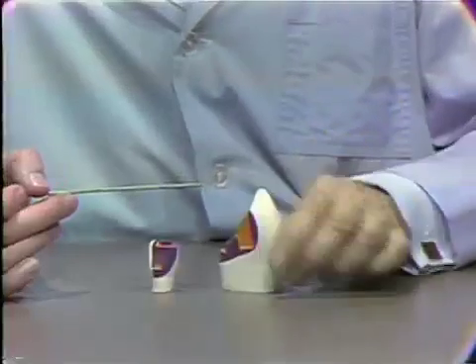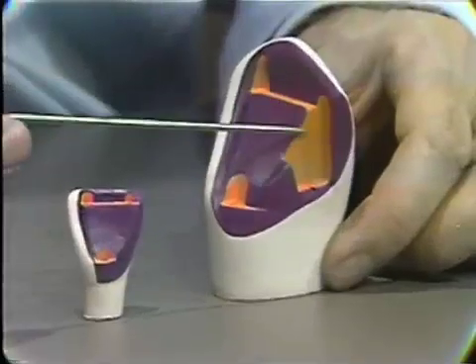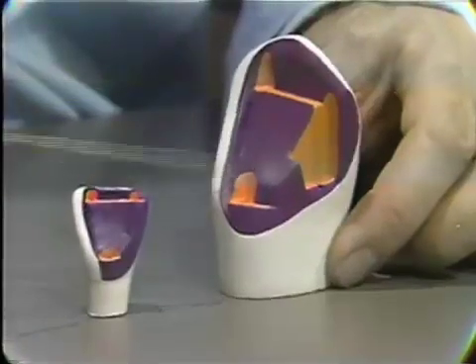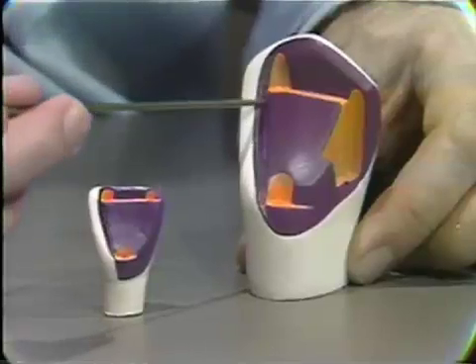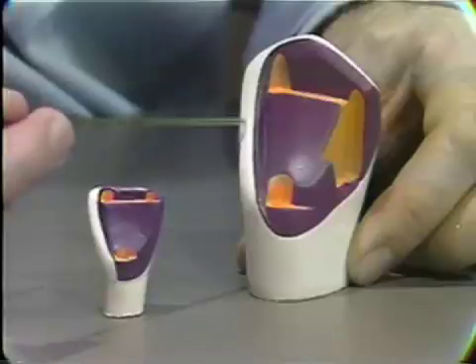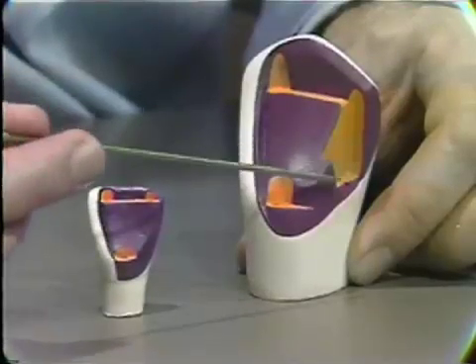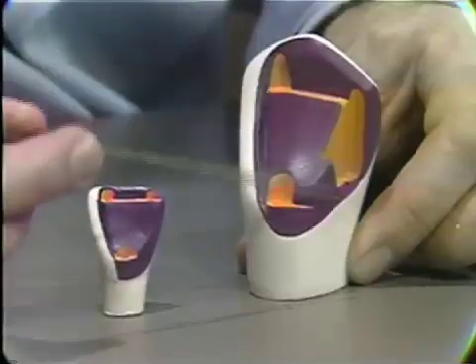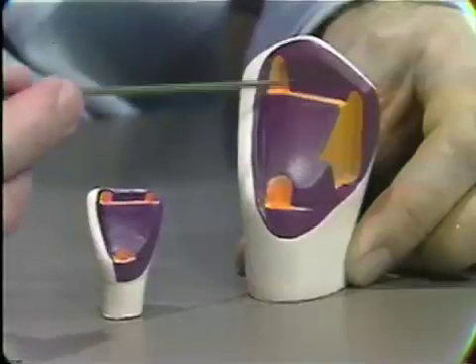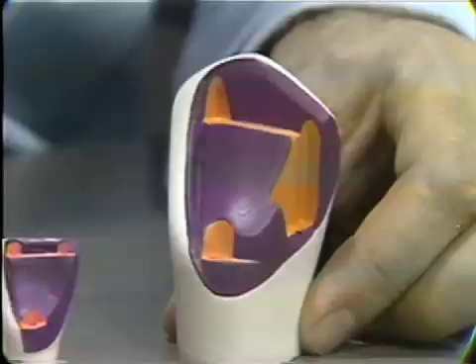Here is a pin ledge preparation on a mandibular cuspid tooth, one in which the box type of retention has been placed on the proximal with two pins in this situation. Notice here the groove which runs down the mesial surface of a unilateral pin ledge to give here an adequate bulk of gold, which compares to the bulk of gold in the slice area on this side, so that we get a quadrangle of gold here from which the retentive devices originate to give rigidity and strength to the preparation.